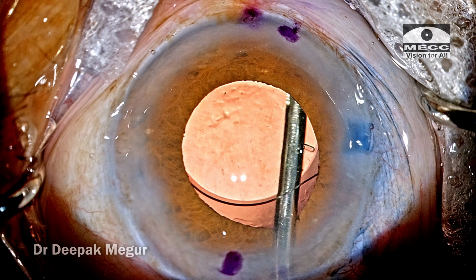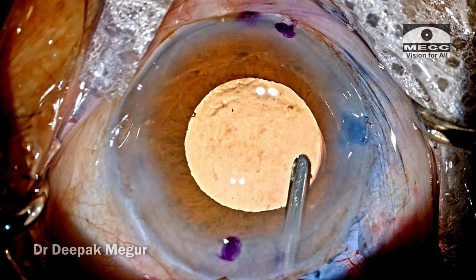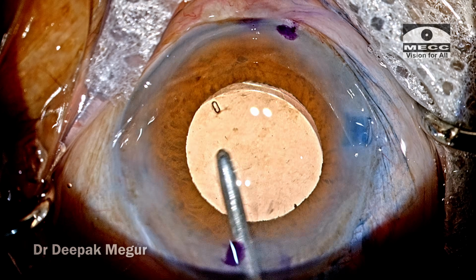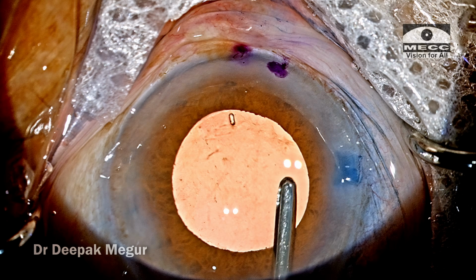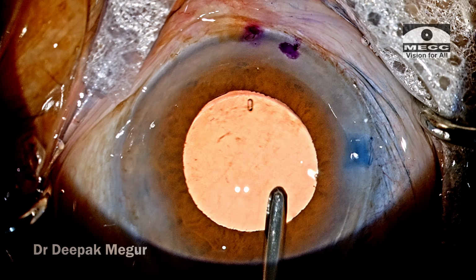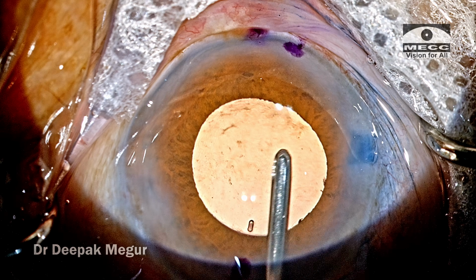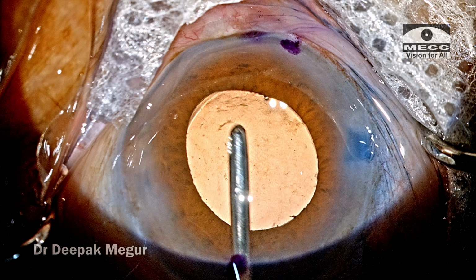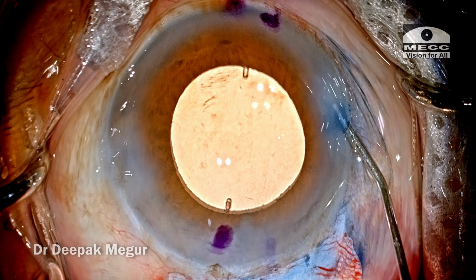Time to remove the OVD. I prefer to always use just the irrigation to flush out all the OVD, both in front of and behind the lens. And then the time to orient the lens along the axis. Using the irrigation cannula, the lens is gently nudged and brought near the axis. I felt the alignment of the lens was good enough, so I didn't want to go in and again rotate the lens. The side ports are hydrated.